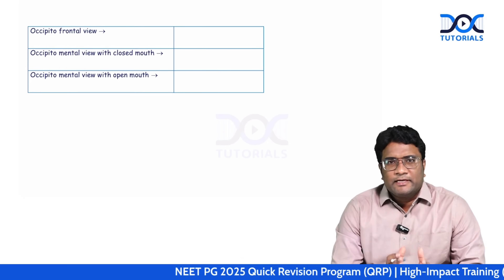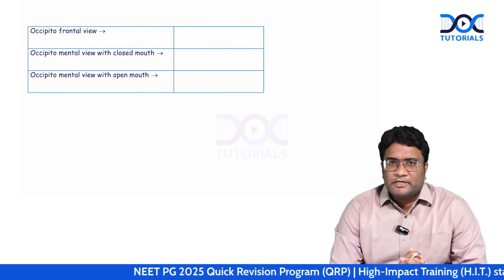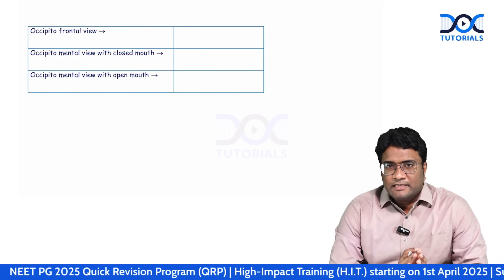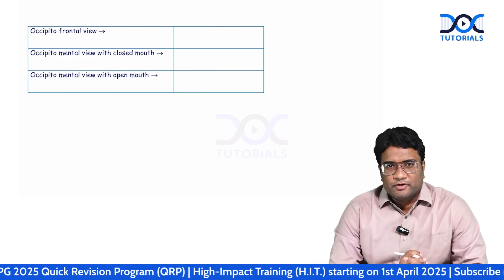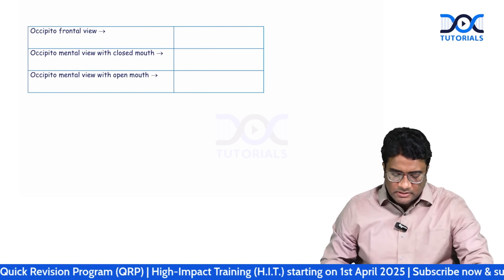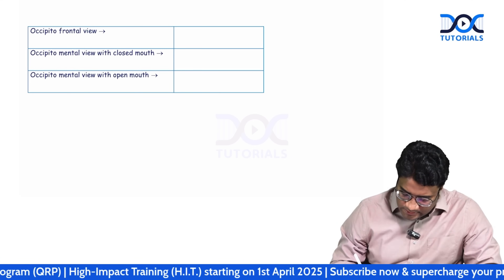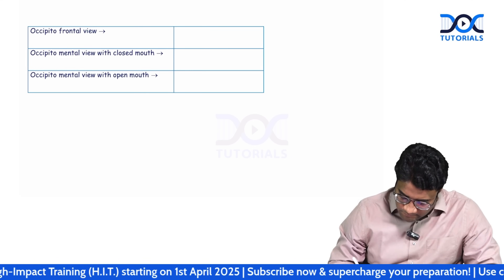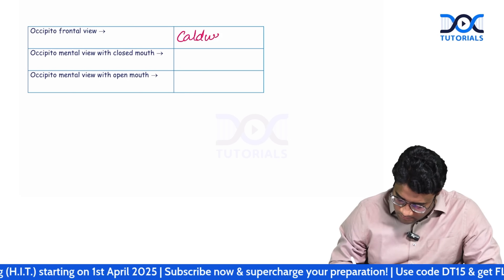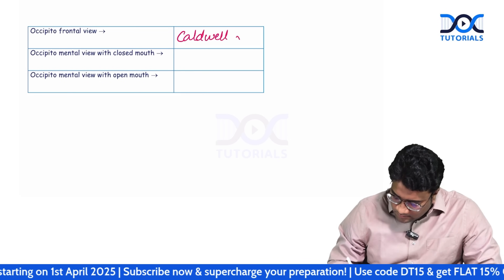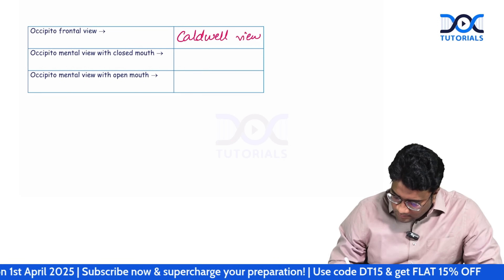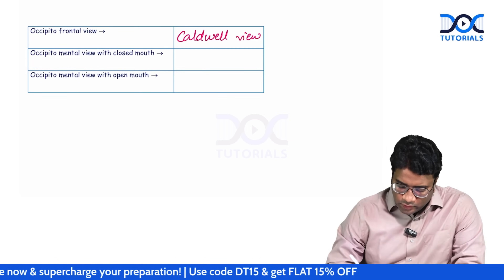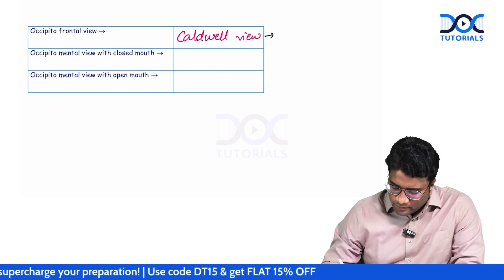Let's quickly look into some important radiographs. The first is the occipitofrontal view — this is the Caldwell view. What is the Caldwell view used for? This is for the frontal sinus.